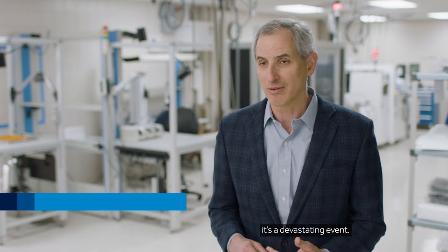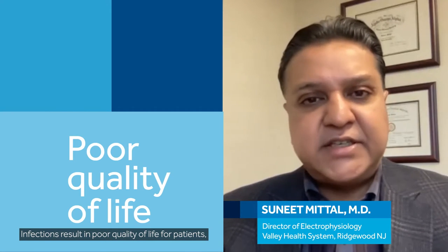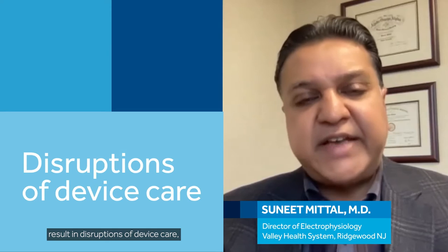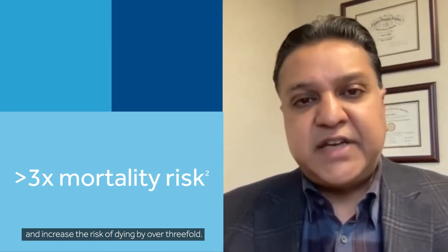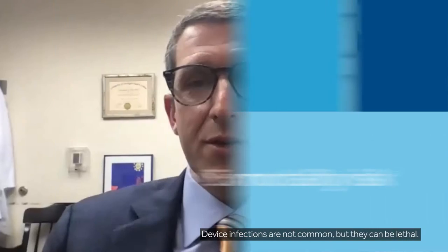When someone does get an infection associated with a CIED implantation, it's a devastating event. Infections result in poor quality of life for patients, result in disruptions of device care, increase the cost of care, and increase their risk of dying by over threefold.